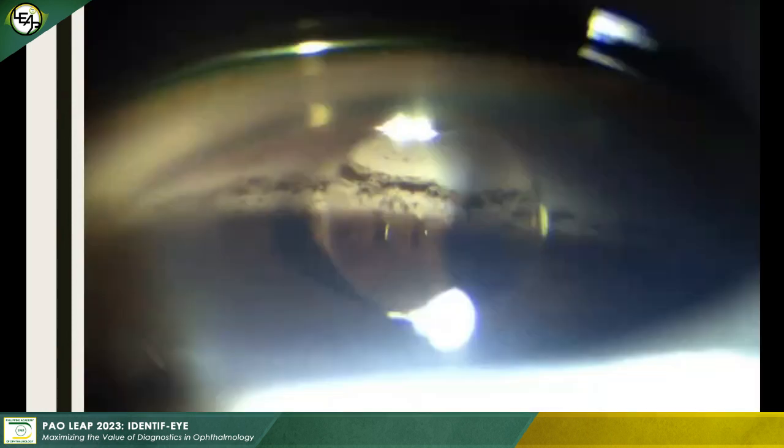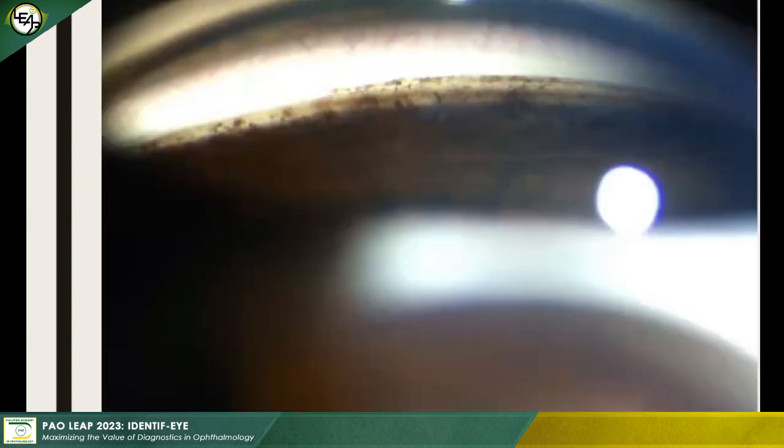Here's another variation in the angle appearance. Sometimes you see foreign bodies in the angle. Technically, this is a foreign body. It's a blob of silicone oil that is seen in the angle. So for this, notice the very highly pigmented angles. Yes, your angles are pigmented, but in this situation, there's very prominent pigmentation. The ciliary body band is very densely pigmented. So is your trabecular meshwork and even your Schwalbe's line.